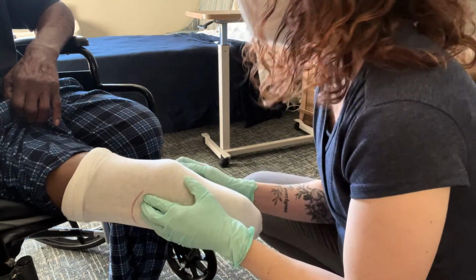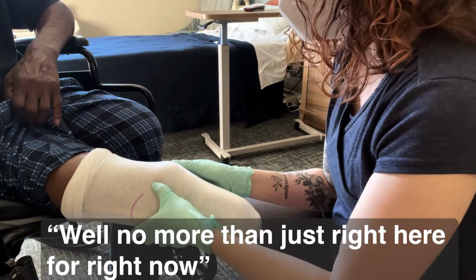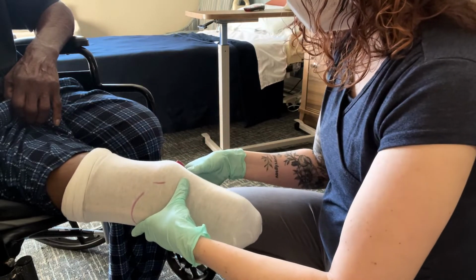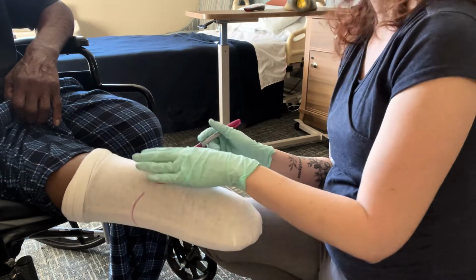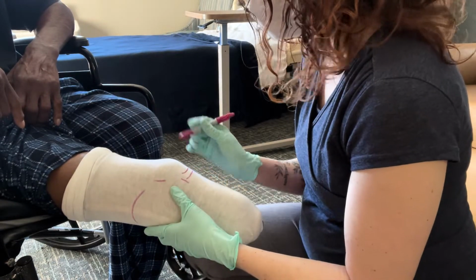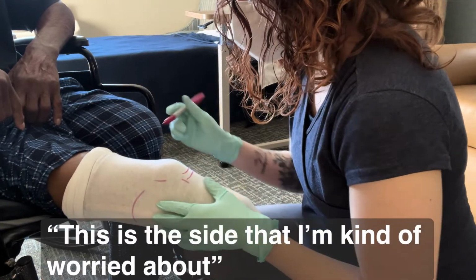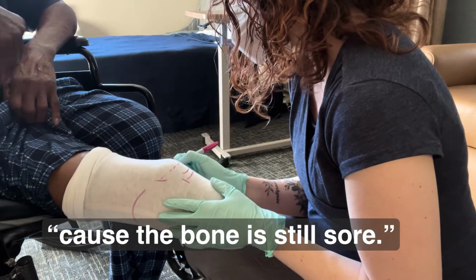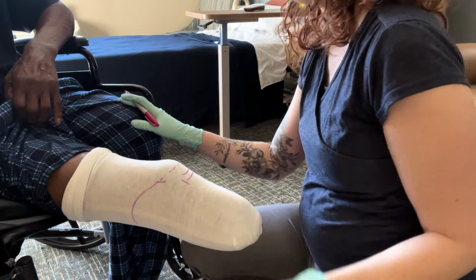And how much walking were you doing with it? No more than riding right now. Just up and down the hall. So you're just hopping on this side with a walker? Yeah. Once we get you this side, that will make it easier on this side too, so you're not putting so much pressure. This side I kind of worry about because the bone is still sore. Yeah, big bone. And that's where the massaging on this side will help too.